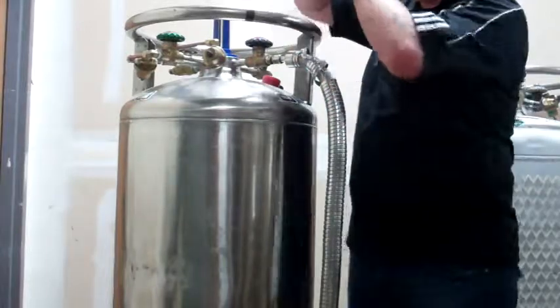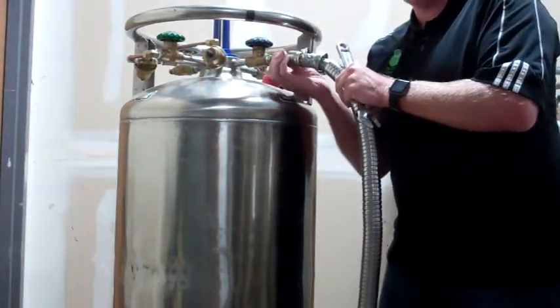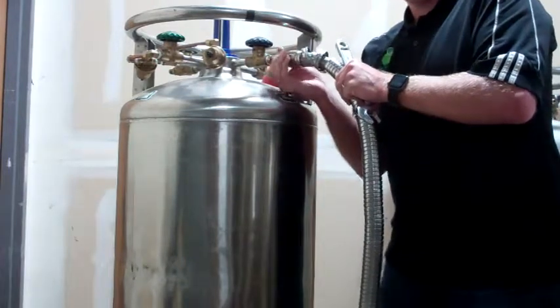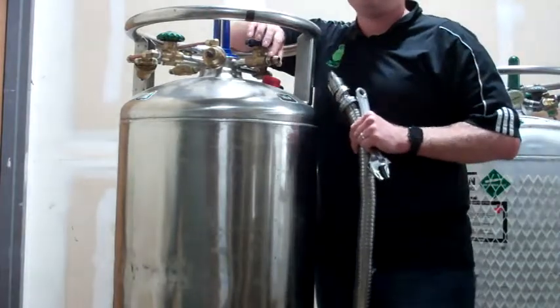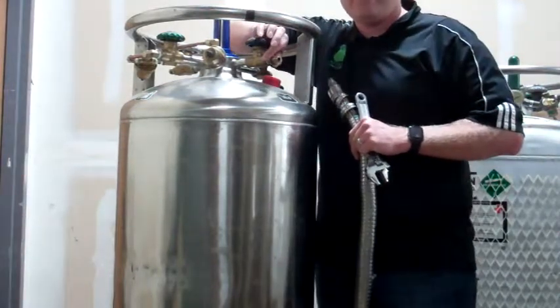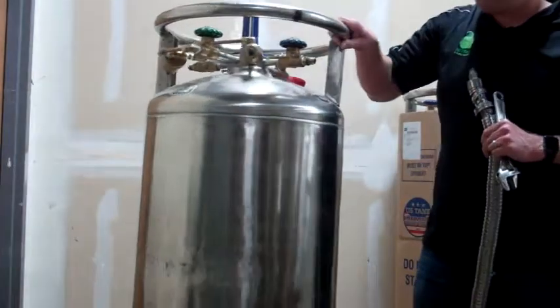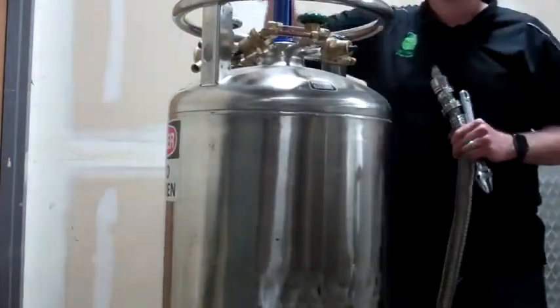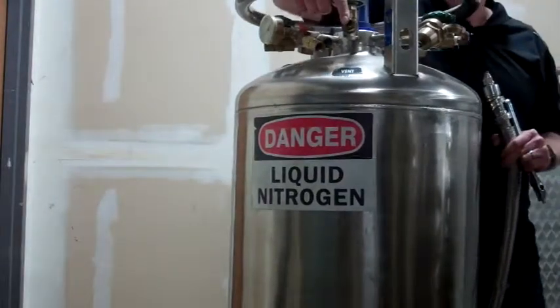What will happen is the threads will become so stripped that you won't be able to put the hose on anymore. If that happens, one of our technicians will replace this brass fitting on the next visit. If it's an emergency, we also supply an extra fitting on the vent side.